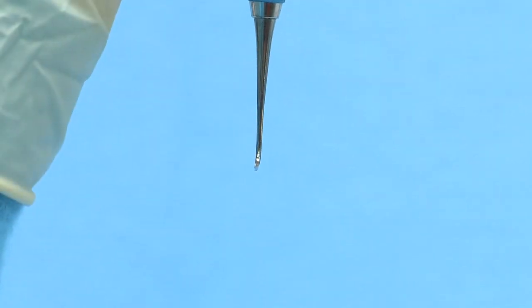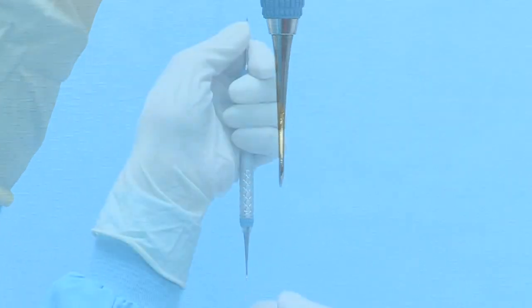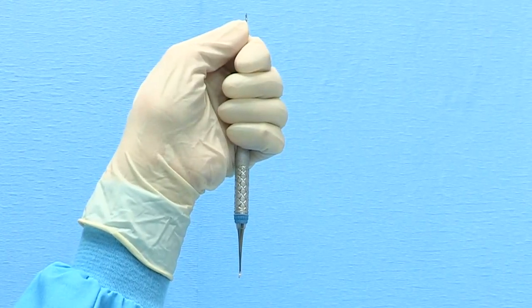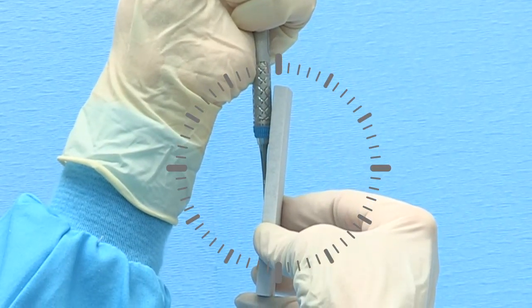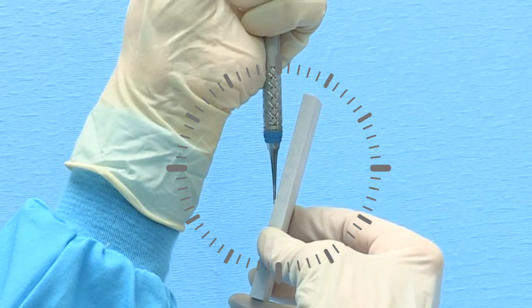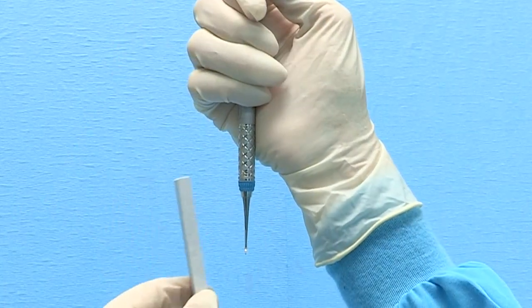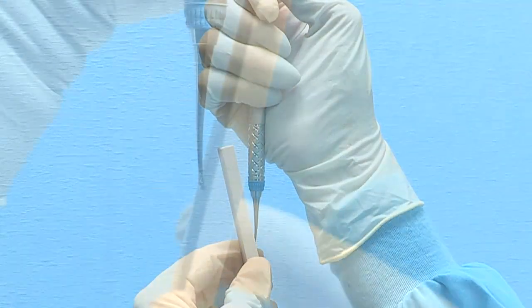To sharpen the opposite cutting edge, turn the instrument so that the tip is pointed away from you. Maintain the secure palm grasp and brace the top shank with your thumb, keeping your elbow on the table in front of you. Position the lower terminal shank at 12 o'clock. Position the lubricated stone upright at 12 o'clock. Right-handed clinicians should tilt the top of the stone slightly to 3 minutes past 12 o'clock. Left-handed clinicians will tilt the stone slightly to 3 minutes before 12 o'clock.